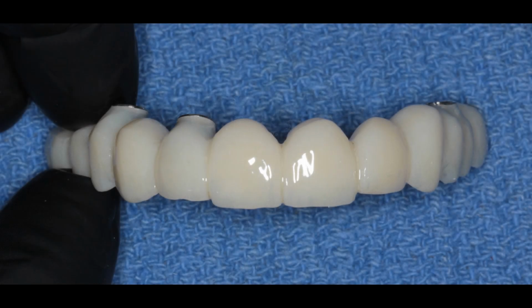This is the temporary that she left here with after her second surgery. And you can see the cylinders are a long way apart between the right lateral incisor and the left first premolar. So this area is going to be weak. Her teeth are fairly short. That's going to be one problem. And her bite force is strong, and that adds to that problem.